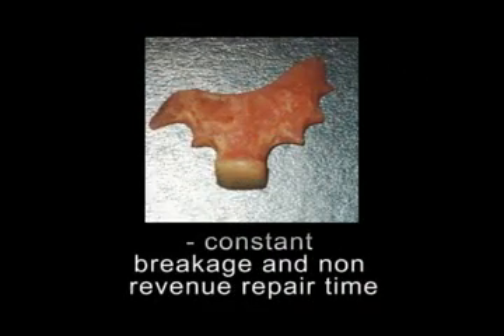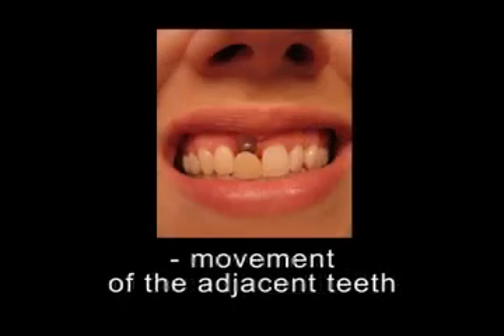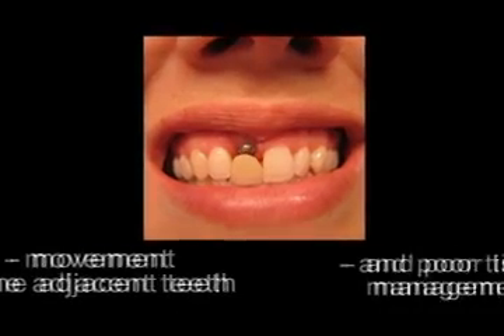For years, patients have been provided the traditional flipper. With constant breakage and non-revenue repair time, no assurance patients will wear the uncomfortable removable, there was movement of the adjacent teeth, and poor tissue management.